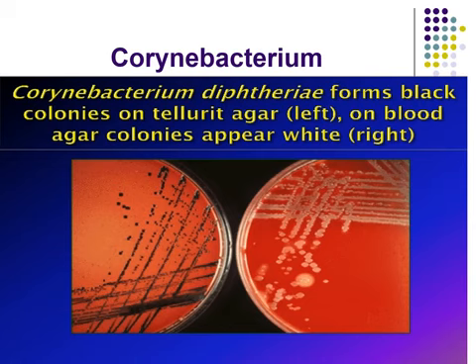So the first step in diagnosis of Corynebacterium diphtheriae is by isolating this bacteria.